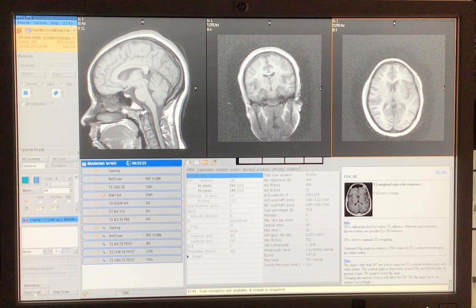Okay? So that's all you do for step 4. You say, okay, Mary Jo, I'm going to give you contrast now. And then you tell the instructor, I'm going to go ahead and give 14 milliliters of contrast. And you're done with that.